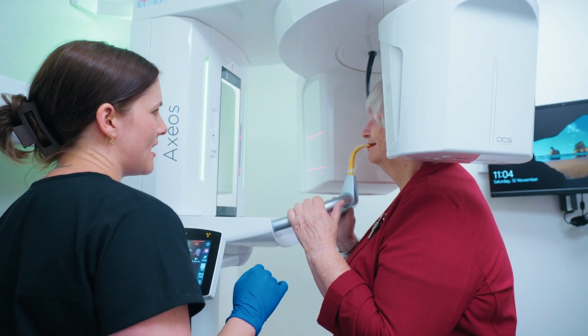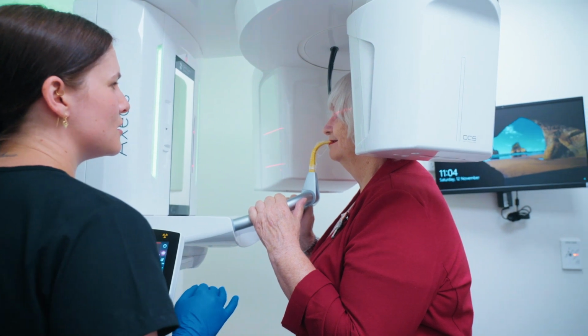With 3D dental X-rays, they really aid in our planning, particularly for dental implants. We use our cone beam machine, we use our intraoral scanners. We've got software that can merge those two data sets so that we can really plan where the implant needs to be placed and where the crown needs to be placed.